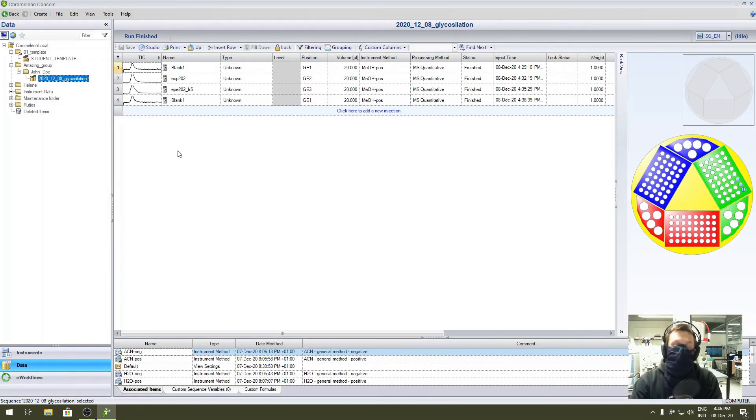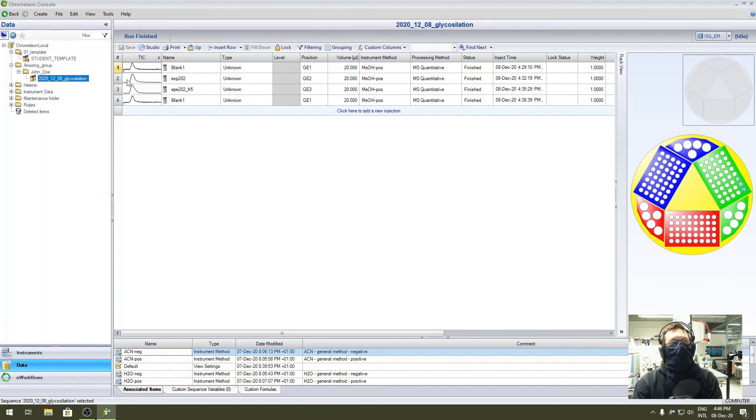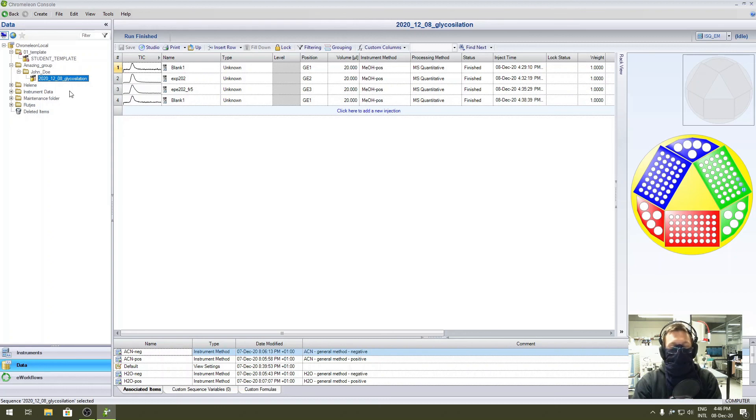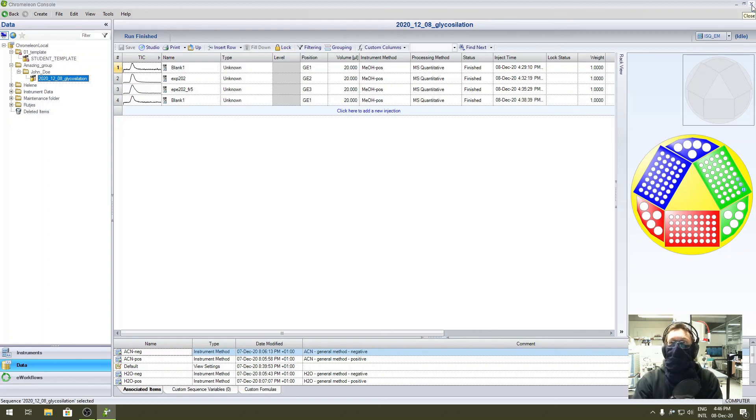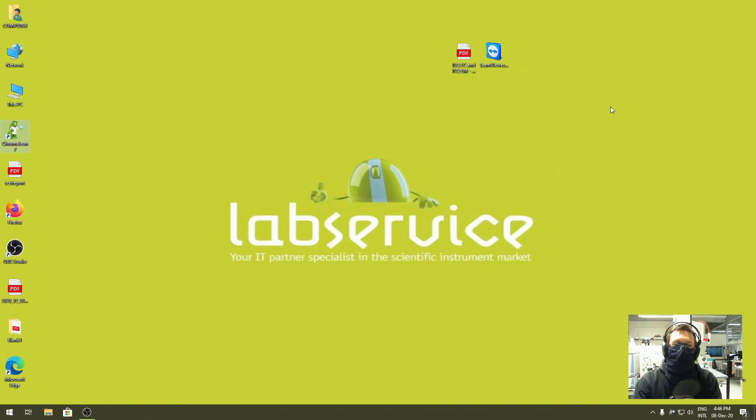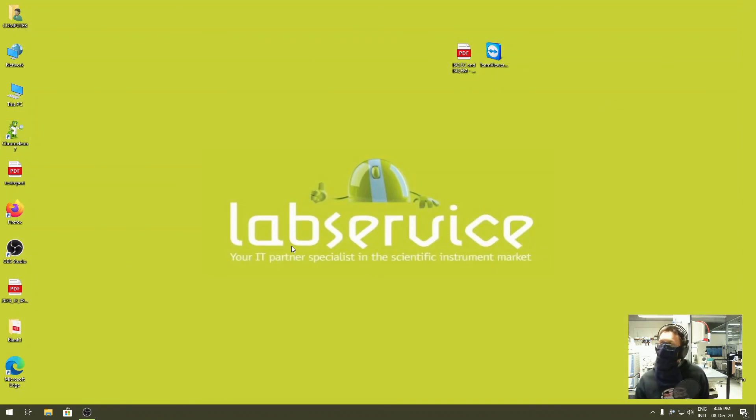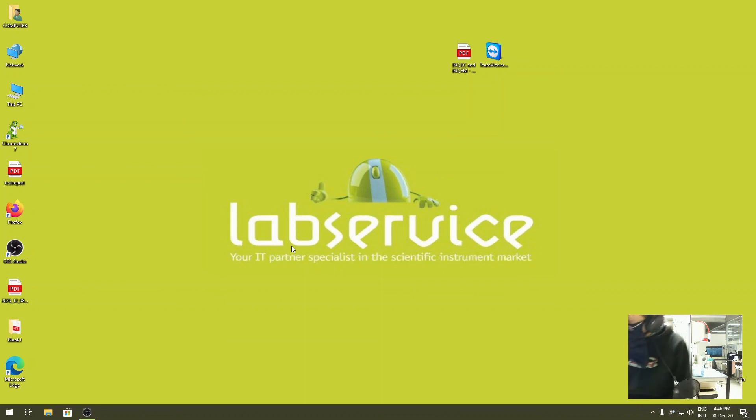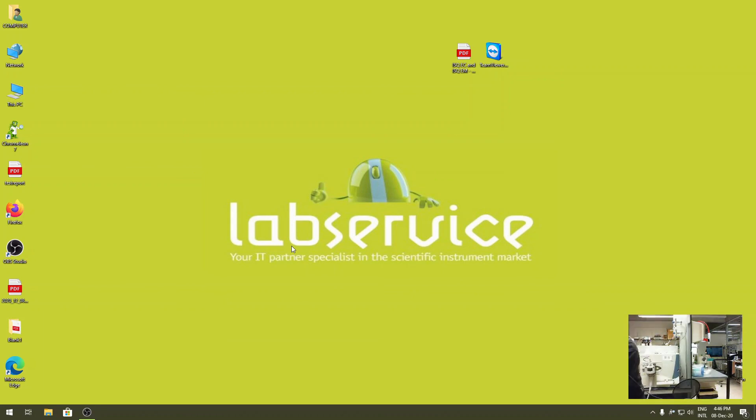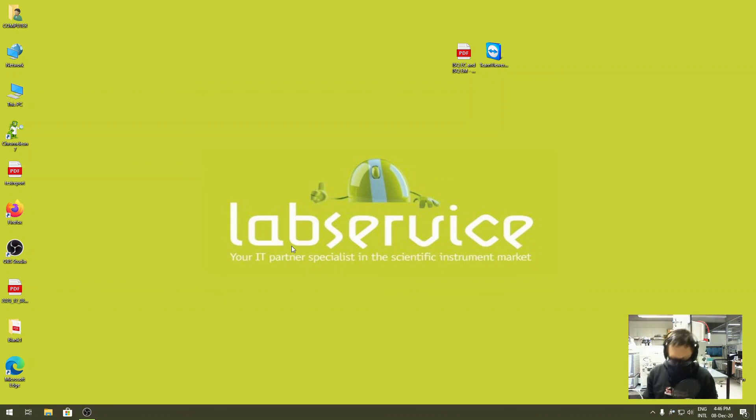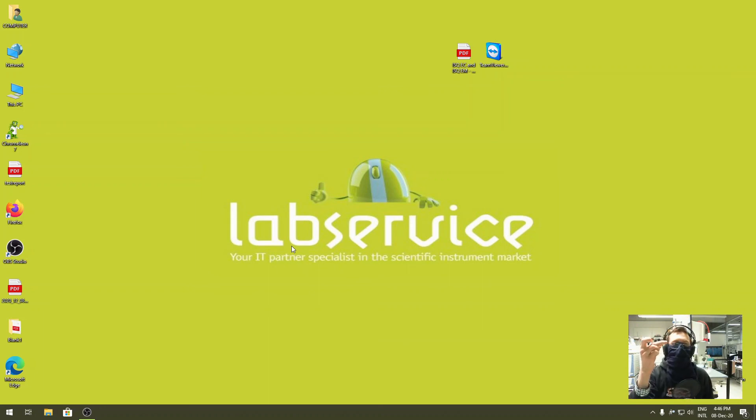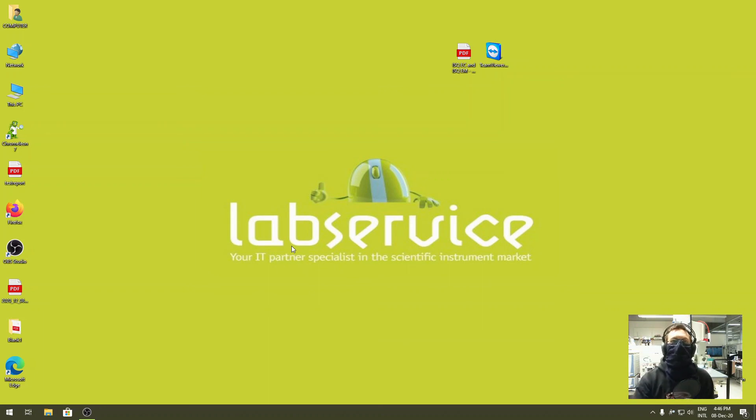For the future, there will be an export in PDF from the system, so the records will be stored electronically on the network share. So that's it. At this moment you can close Chromeleon. You know you did the job right. Don't forget to take out the samples. Once you have the samples, you are free to go. Good luck.